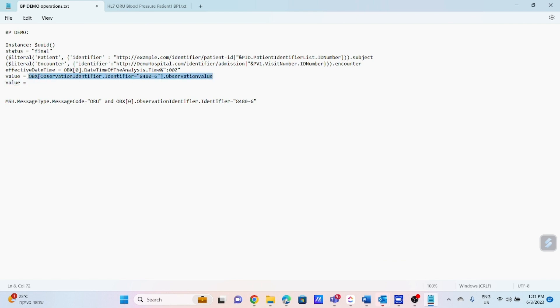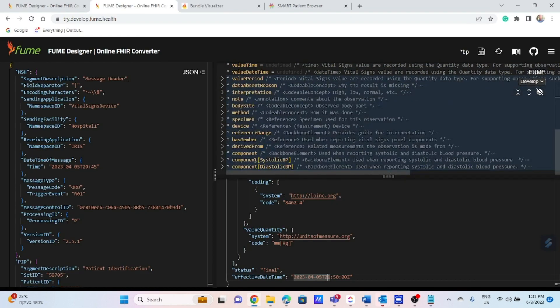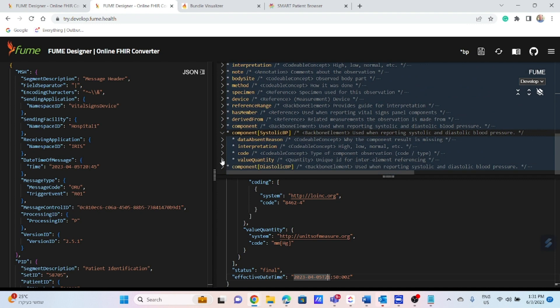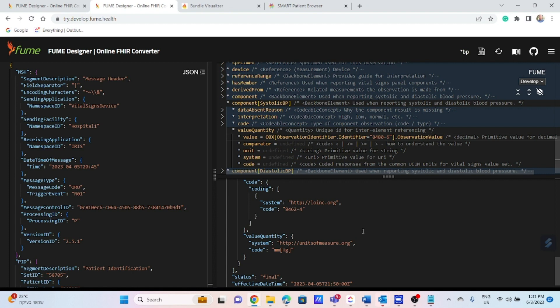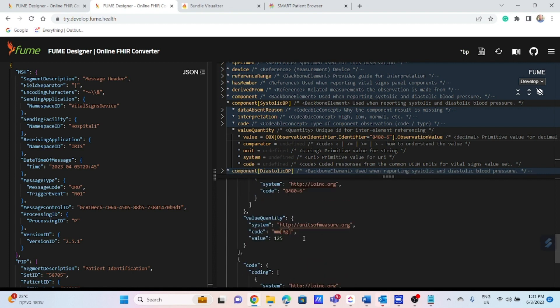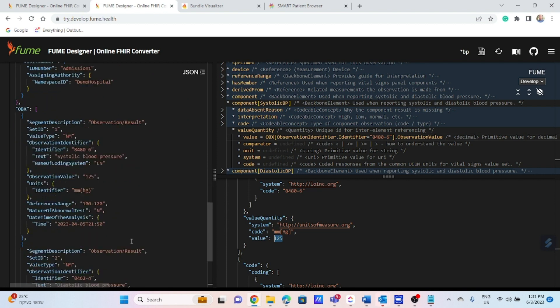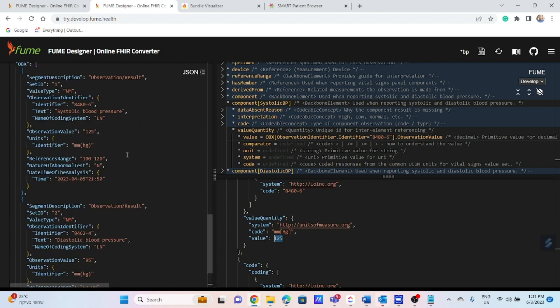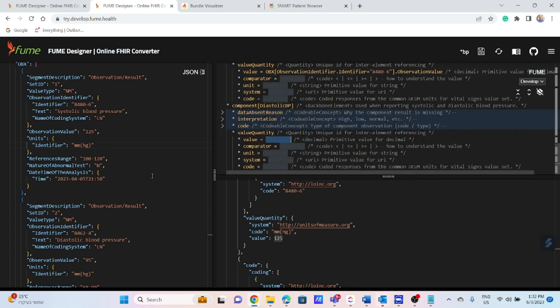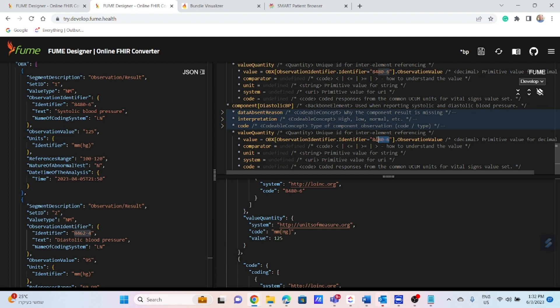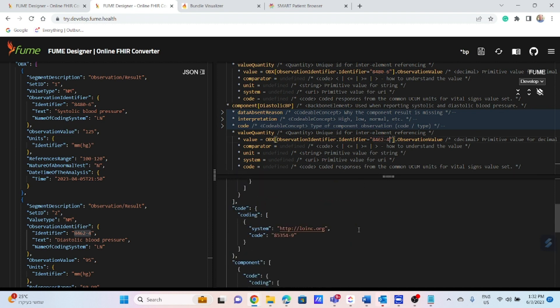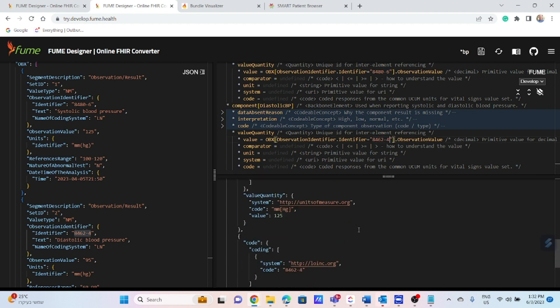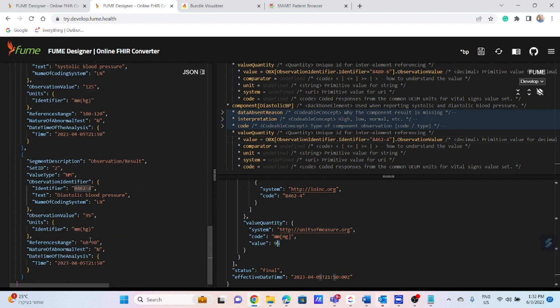Next, we will take the systolic and diastolic values and map it in appropriate and correlated places. We automatically got the result correlated with the source message, 125 for systolic. And the same we will do for diastolic. We got it, 95. It is correlated with the result of diastolic pressure.